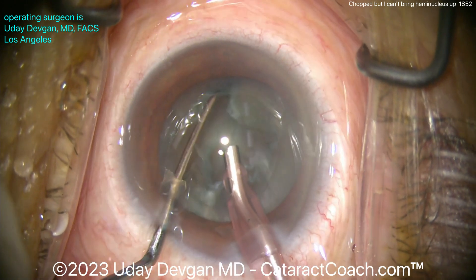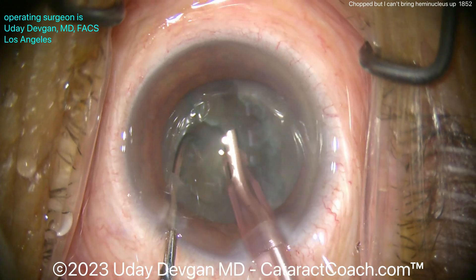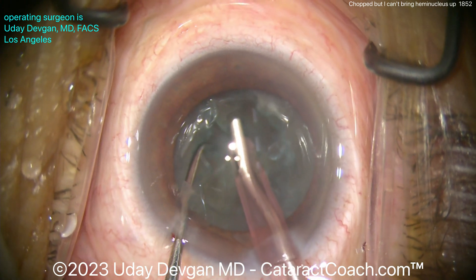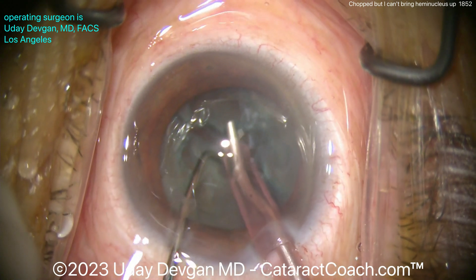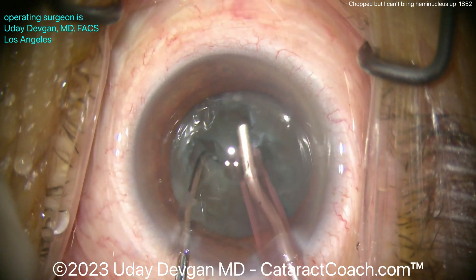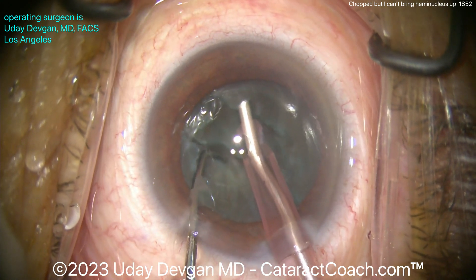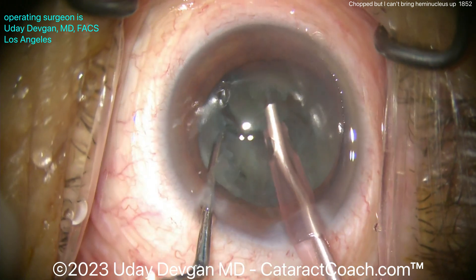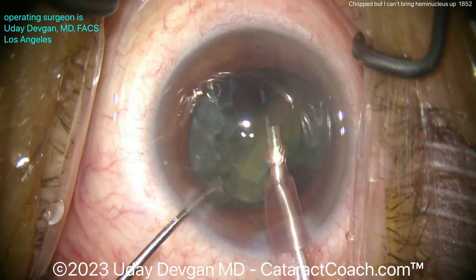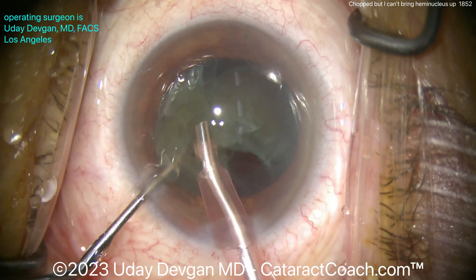The most common cause of not being able to bring up a nuclear piece or nuclear half is that you didn't fully separate the pieces — you didn't propagate the chop all the way through. Once I get that chop propagated, it's going to be a lot easier to bring the piece up. Watch — it's not probably there yet; that's the last sticking point in the center at the posterior aspect. Now it's two fully distinct halves, and now it's easy to bring them up. Go into them again and the half comes up — that was the issue.